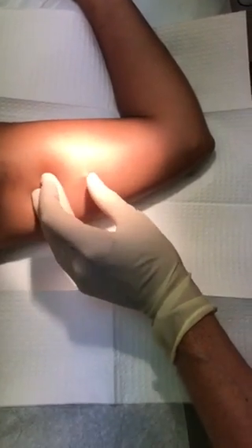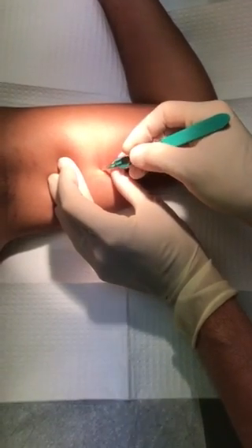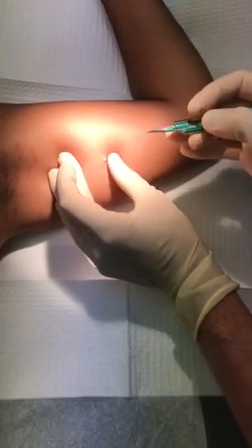What I usually do is just find the previous scar right there and tip up the end of the implant so that it's right underneath the scar, then take an 11 blade and just open that scar up — just barely.